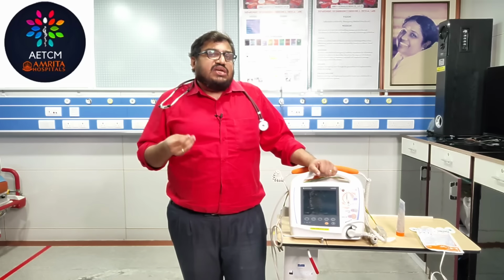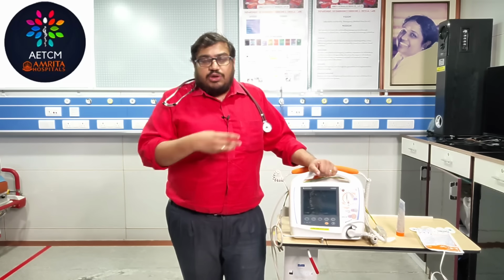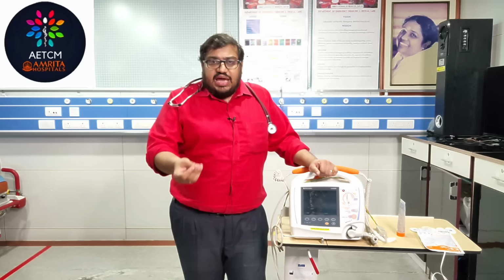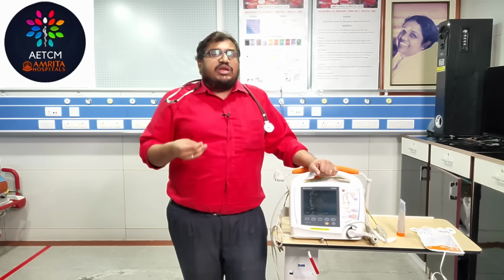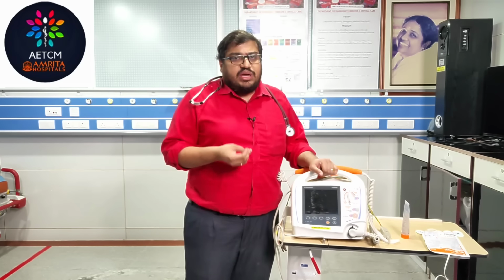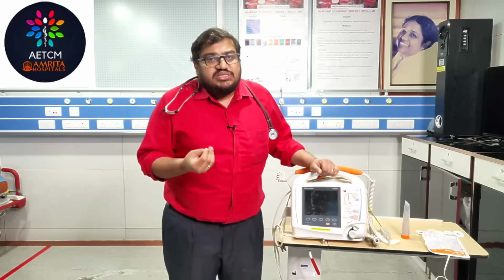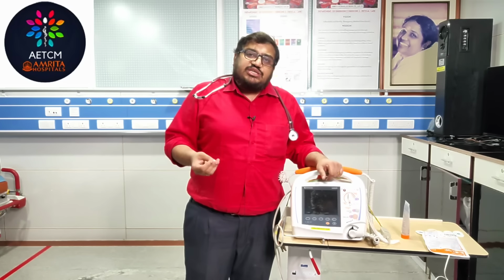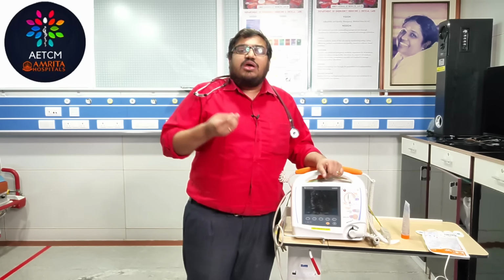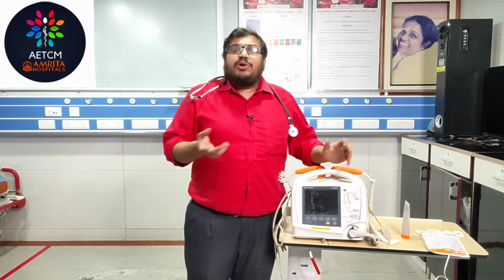There is a high chance that he can go into a cardiac arrest also. If you are not treating, he can also go in for an arrhythmia and cardiac arrest. But this is again a painful procedure. You need to explain this to the patient, and proper procedural sedation is needed. So again, the question comes, what procedural sedation is needed? You can use a smaller dose of midazolam or morphine or fentanyl, depending upon your institutional protocol.